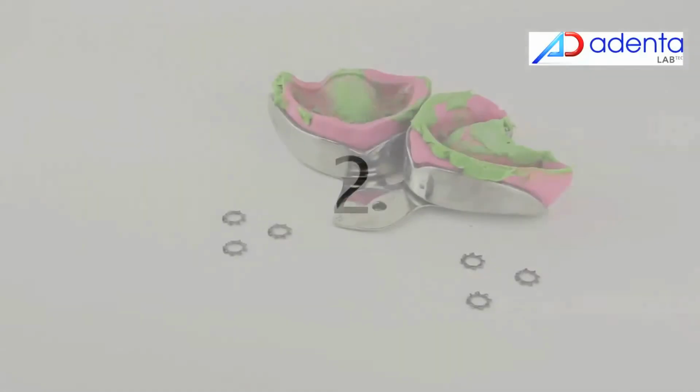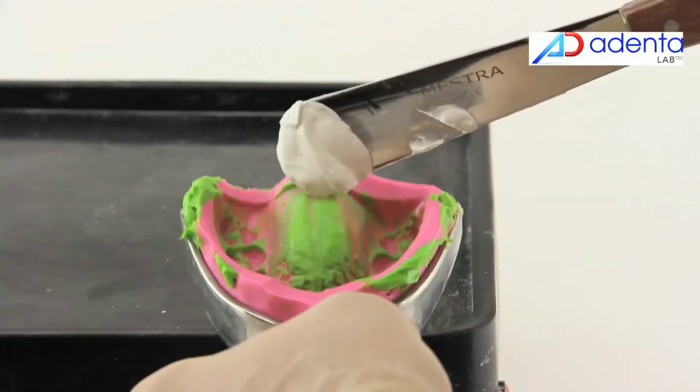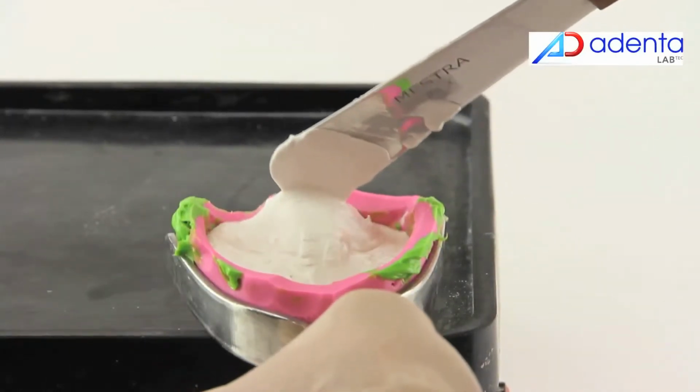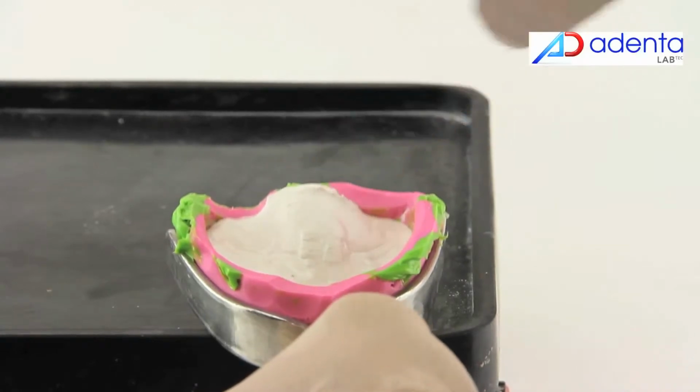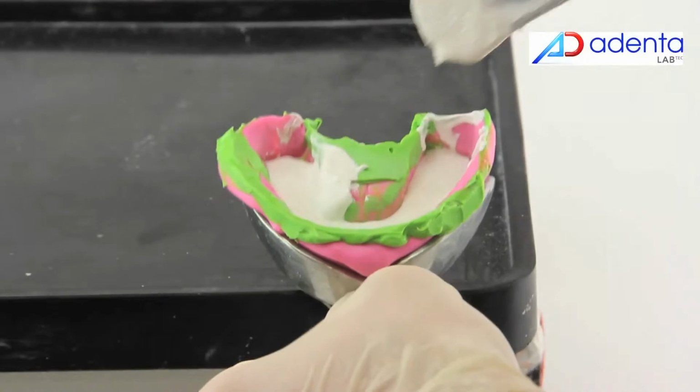Chapter 2: Pouring the impressions. The impressions will be poured using white stone plaster for orthodontic study models. Only dental and alveolar zones are poured.